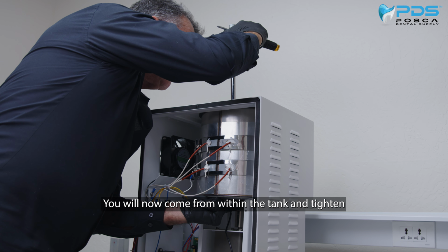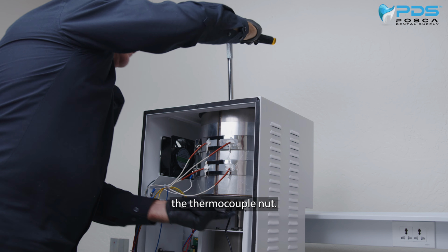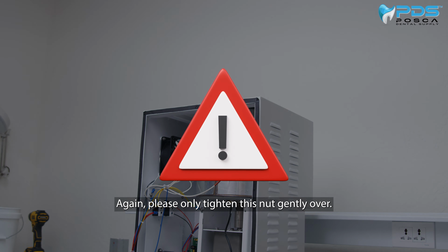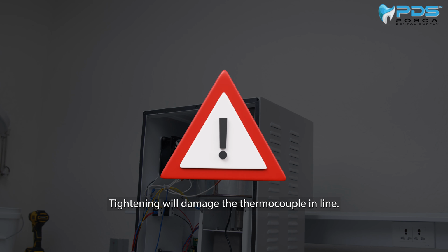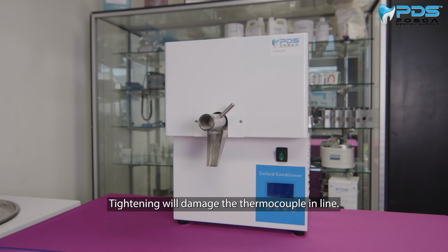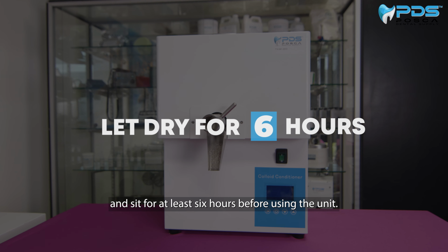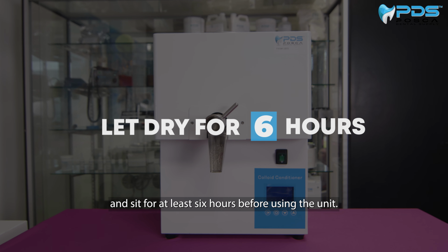You will now come from within the tank and tighten the thermocouple nut. Again, please only tighten this nut gently. Over-tightening will damage the thermocouple and line. Please note the heat-resistant silicone will need to dry and sit for at least 6 hours before using the unit.